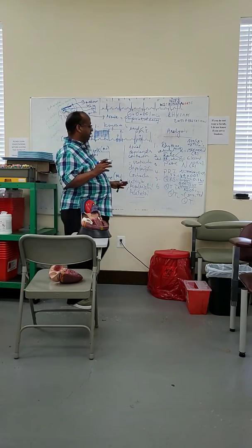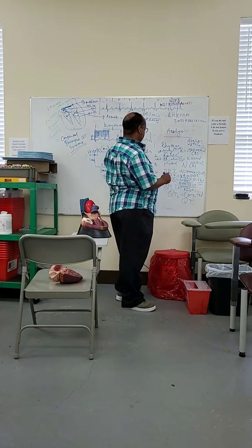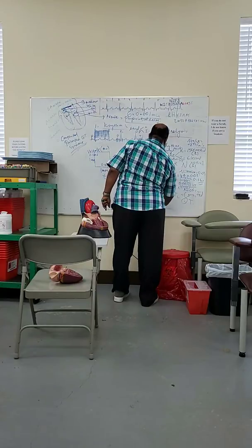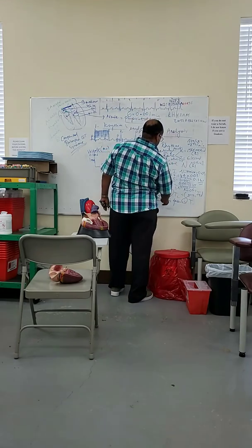To get the corrected QT, what I recommend is going online to the Bazett formula or corrected QT calculator.